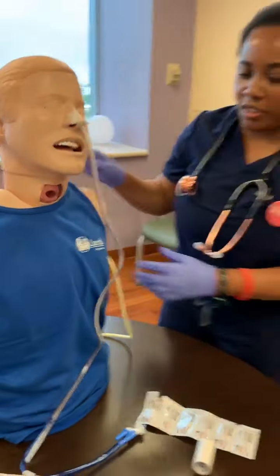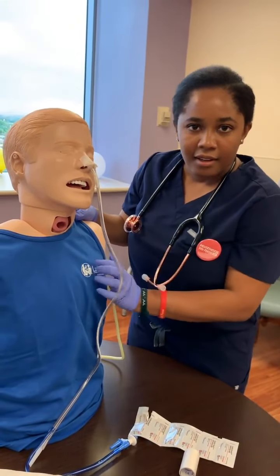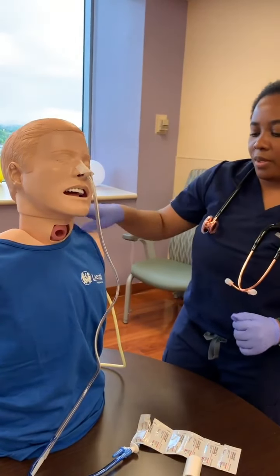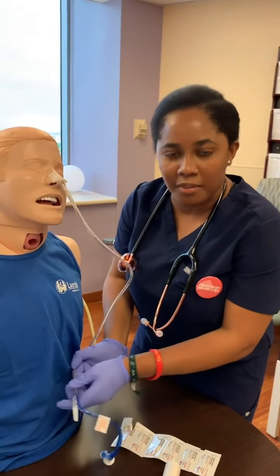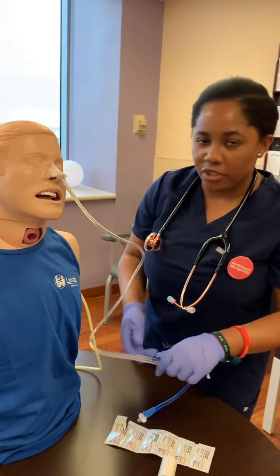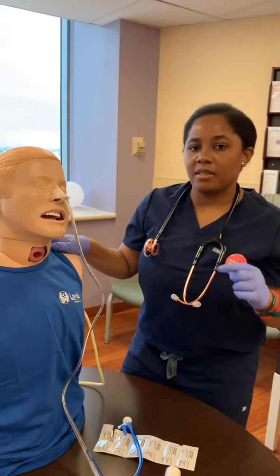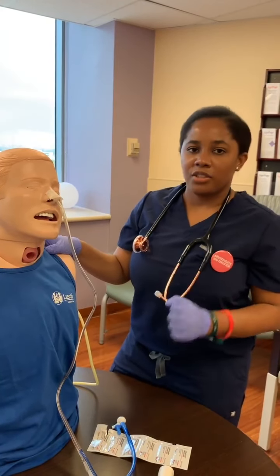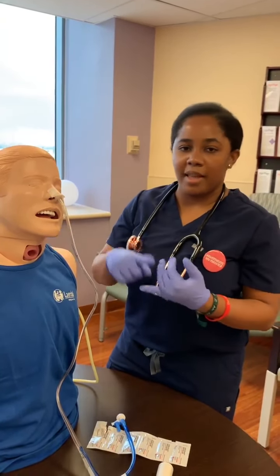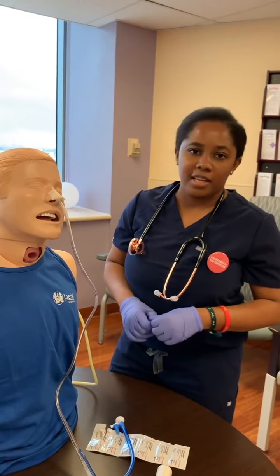So you have your tube. What you're going to do now is make sure that you're assessing the lungs. You're also going to check the color of the actual output that's coming out, just to make sure that it is actually in the abdomen. But for the most part, whatever facility that you're in, the gold standard to check for NG tube placement is going to be a chest x-ray. So make sure that you do a chest x-ray before you give any medications or put the tube to feedings.